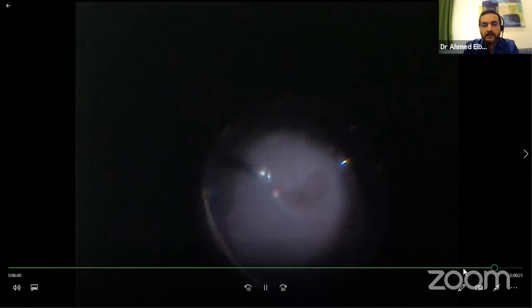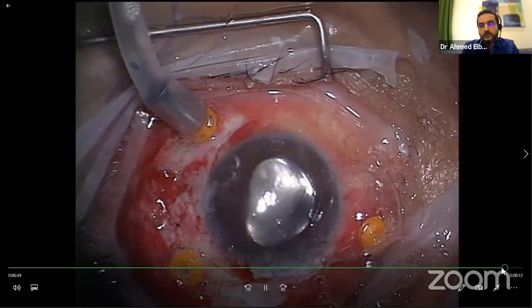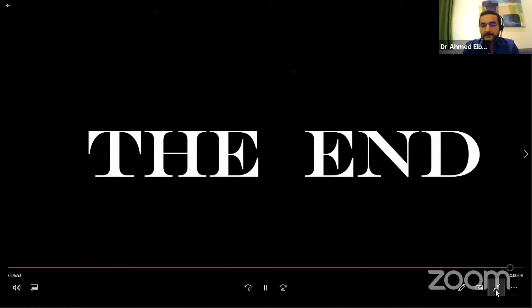So in this patient, in this case, I used gas because there is no retinal detachment, just the tear, and also the macula was, despite the heating effect, a little bit healthy, and the disc is okay. The patient improved, and the vision improved a lot. The idea here is an air-fluid exchange, and we then put the eye on gas.